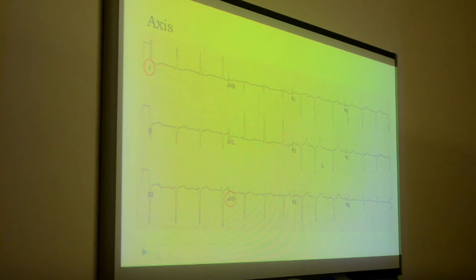Okay. So we said the patient data, the three R's, which are rhythm, rate, relation of the P wave to the QRS. The next thing was axis, and then finally we have components. The components of the ECG, the wave parts.